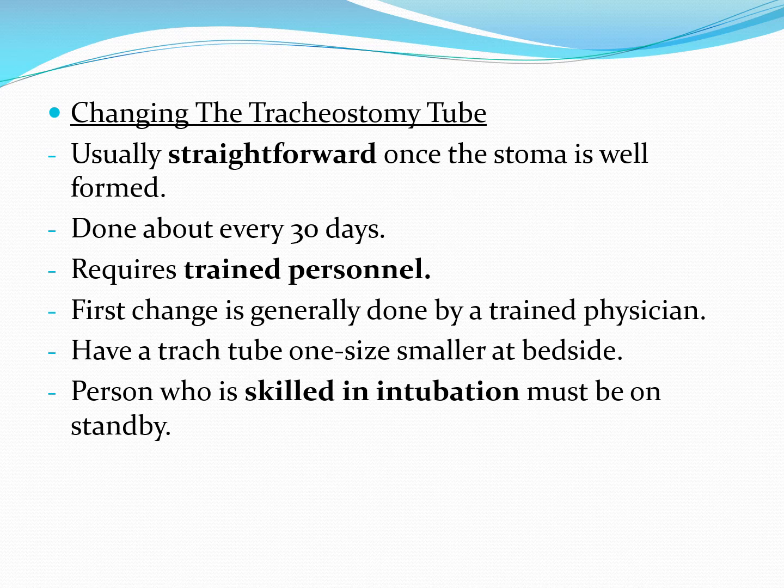A person who is skilled in intubation really should be on standby, in case the tube doesn't want to go in for whatever reason, and even a size smaller doesn't want to go in, or a false trach has been found. We've had cases, in extreme circumstances, where just to get an airway in place, a 6 ET tube was put in through the stoma and temporarily, surgically, a stitch or two attached it until the trach could be reestablished and that trach tube put in place.